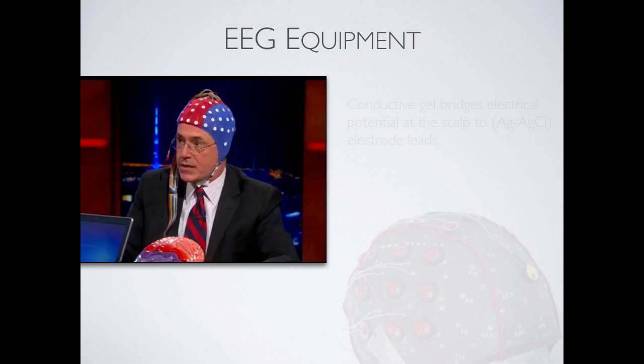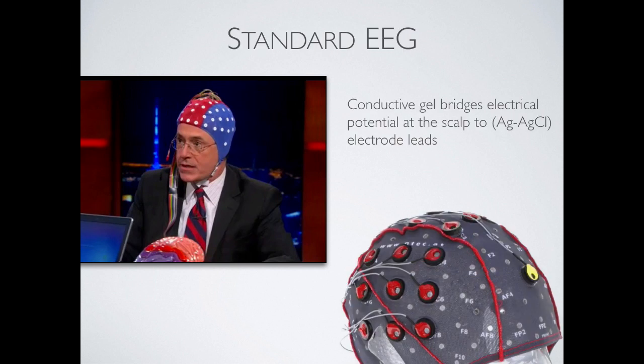Some of you may or may not recognize Stephen Colbert. He's a late night host now. This is him wearing an EEG cap from the brain-computer interface lab that I did my doctoral work in. He's not actually hooked up to anything right now. You can see that the cap is actually quite old. Some of the newer caps look more like this.